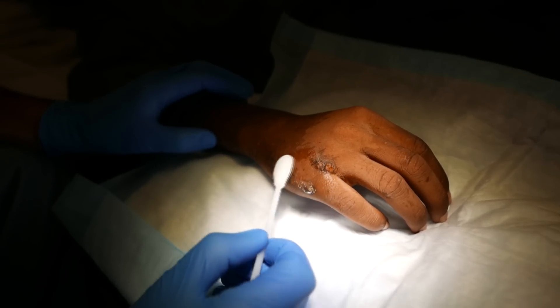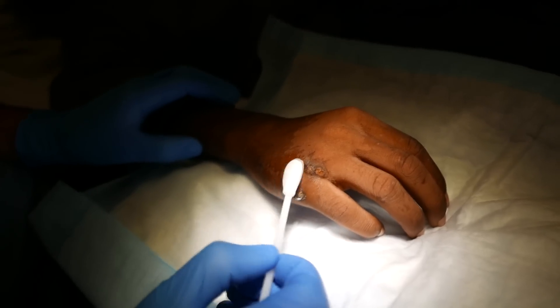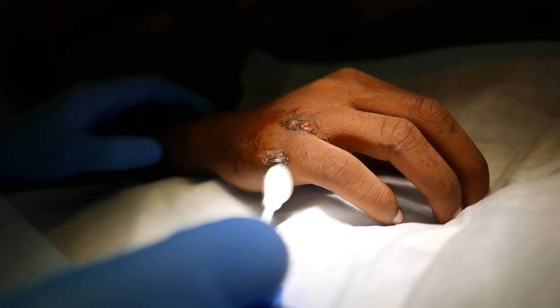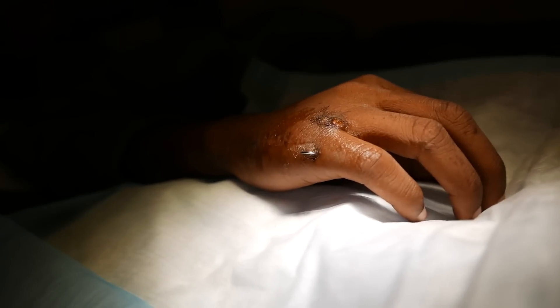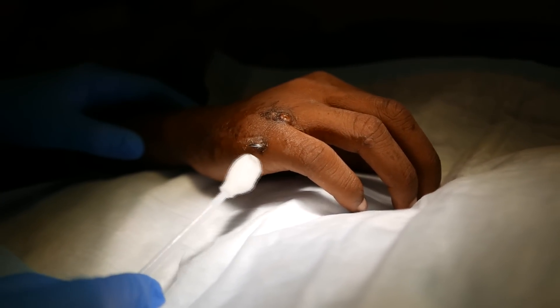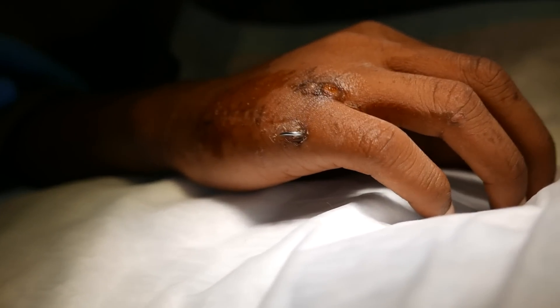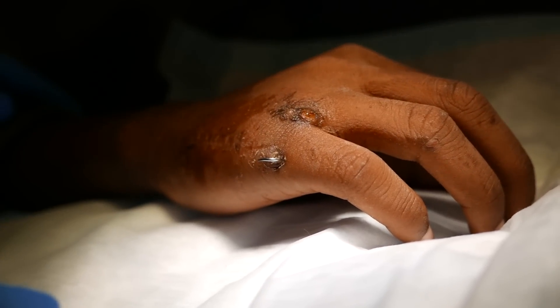Common complications with K-wires include infections along the track site. You can also have loss of fixation — the pin can come out or backtrack, meaning it backs out. They can also migrate inward and go places you don't want, like into blood vessels. And they can break off — that's another potential issue.